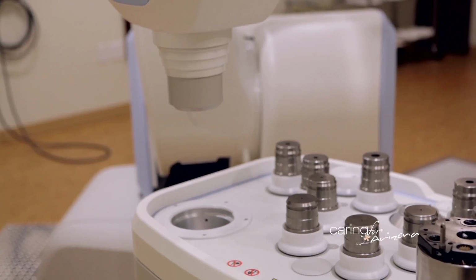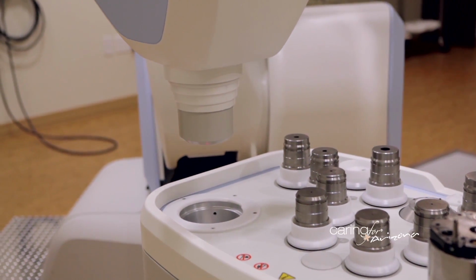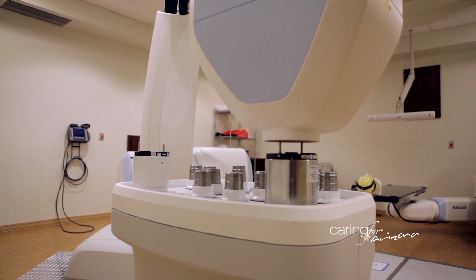The best way to kind of think of this in your mind's eye is that if you went outside, you're not going to burst into flames with the sun's rays. But if you use a magnifying glass to bring all of those sun's rays together in one little point, you can start a fire. And that's kind of the principle behind radiosurgery: hundreds of little radiation beams that are only focused on the tumor.